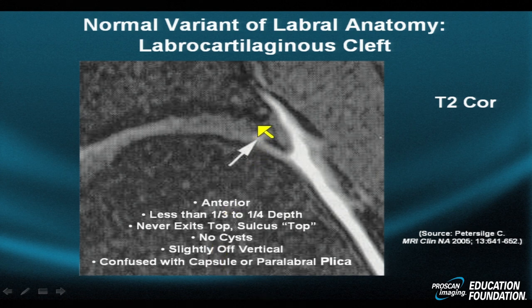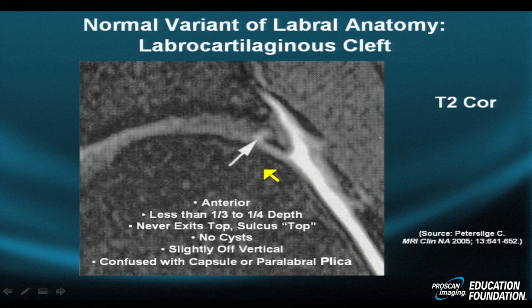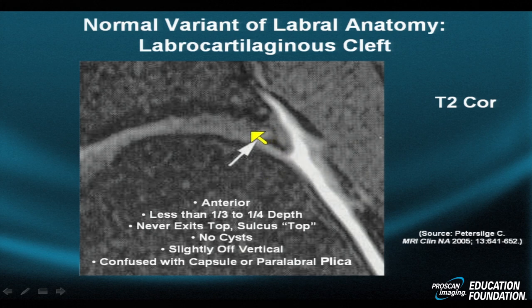We're showing a small curvilinear area of hyperintensity that extends into the superolateral labrum of the left hip. This normal variant presents tremendous challenges to those trying to interpret a labral tear. How can we differentiate this common variation from a true tear? A couple of tip-offs: first, the sulcus is shallow. If it's a developmental fissure, it will also be very shallow. The sulcus has a rounded top or configuration.